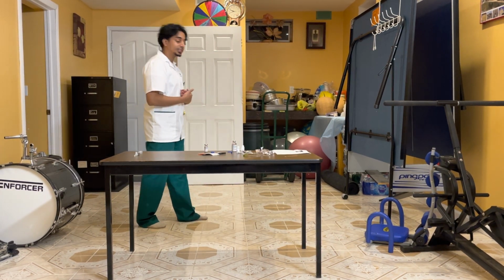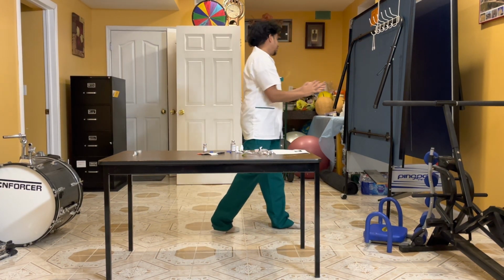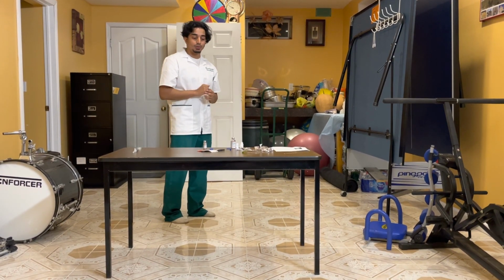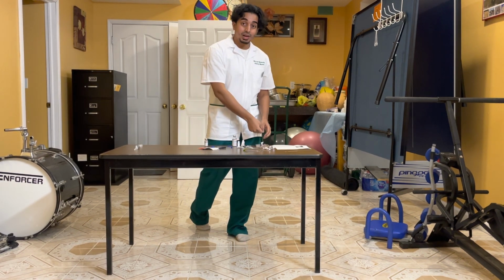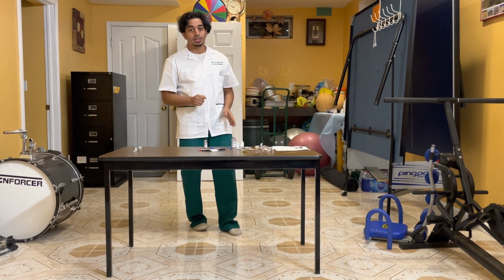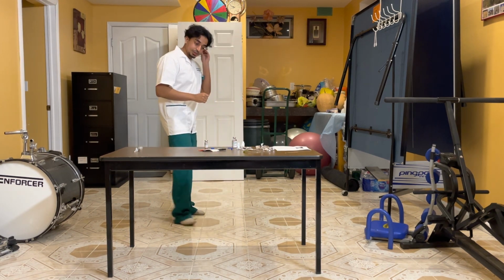First thing I do is I introduce myself and do proper hand hygiene. Okay, now that I've done proper hand hygiene, I do 2 patient identification indicators. But before that, I just wanted to say one thing. While I was in the medication room, I scanned the IV bag to make sure that it is the right medication and the medication is documented onto the MAR. That's just one thing I wanted to point out while I was in the medication room.